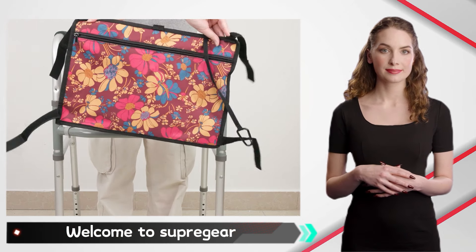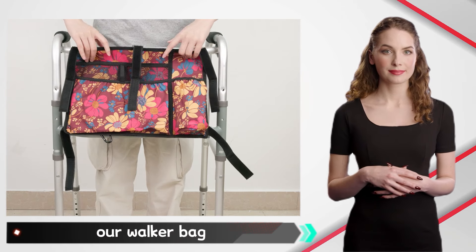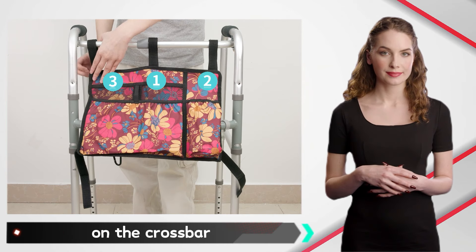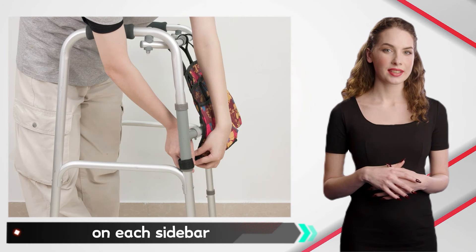Welcome to SupreGear. I will tell you how to use our walker bag. Step one: install straps on the crossbar. Step two: install two corner straps on each sidebar.